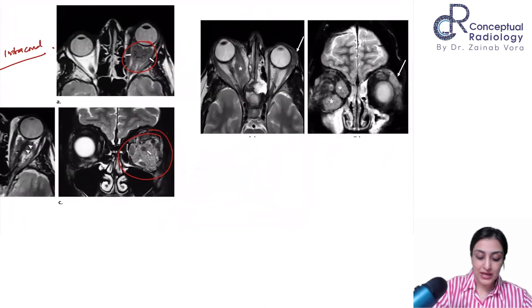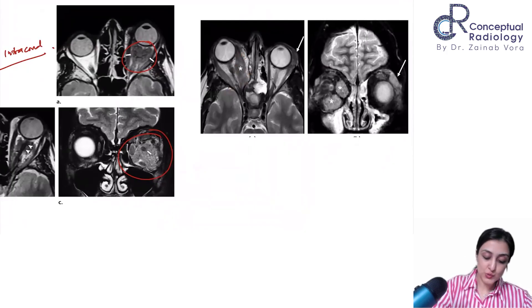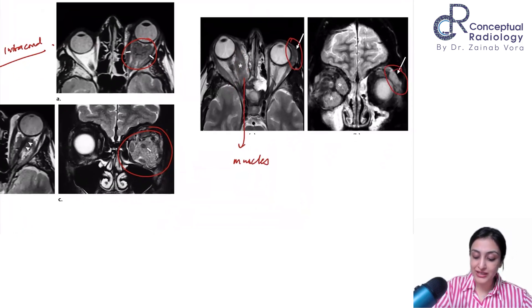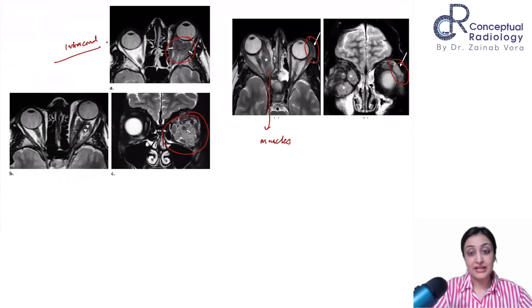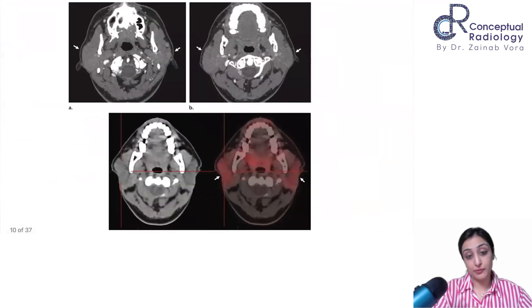In this case, the muscles are bulky without significant tendinous sparing. Even the contralateral lacrimal gland is showing enhancement. This is how your orbital pseudotumor appears.